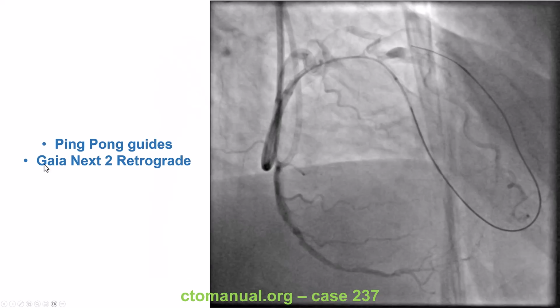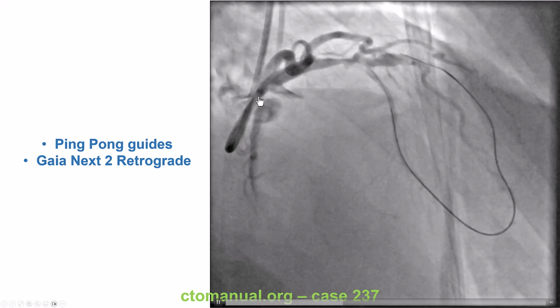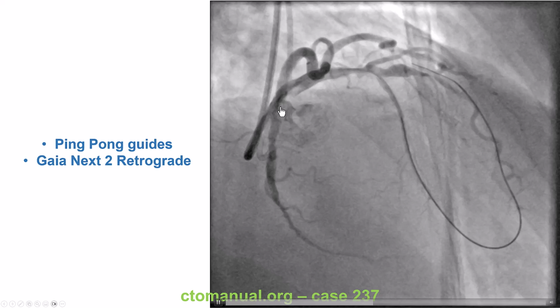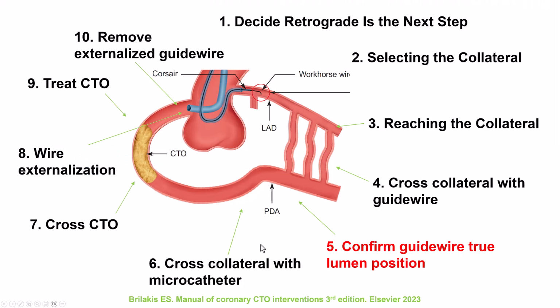If that happens, then one needs to use the ping pong guide often, second guide, because externalizing within the same guide catheter can have issues with the equipment.